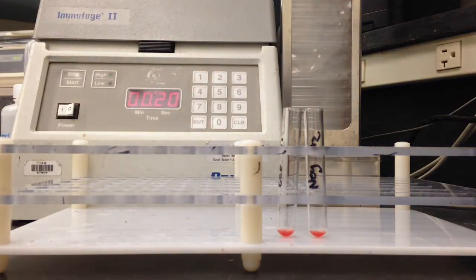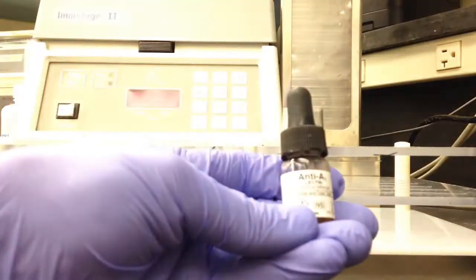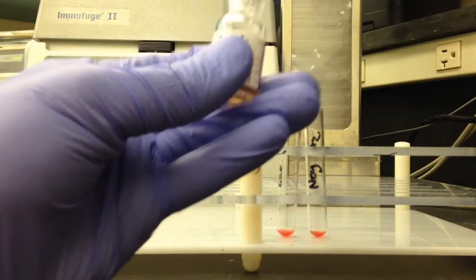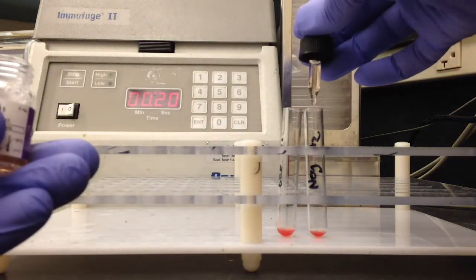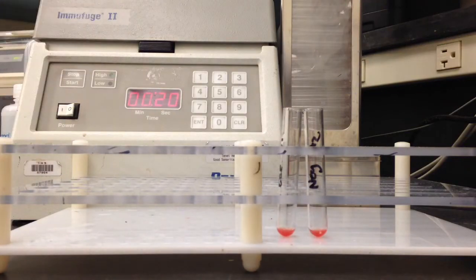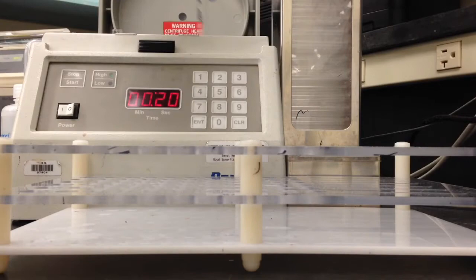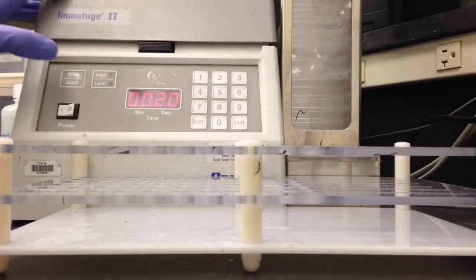So you need to label your tubes, then add one drop of A1 and A2 cells to the corresponding tubes, and then follow that up with a drop of A1 lectin. After you add the A1 lectin you would just mix the specimen and pop them in the centrifuge for about 20 seconds and spin them down.